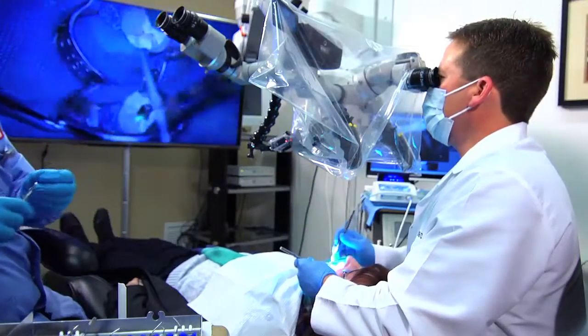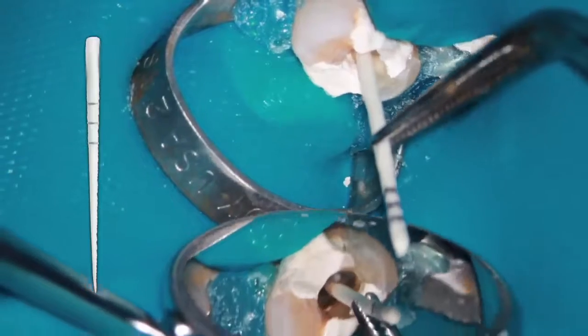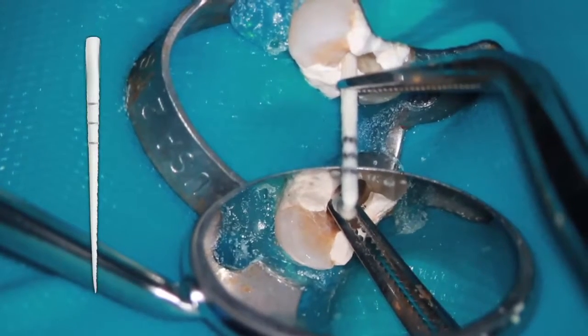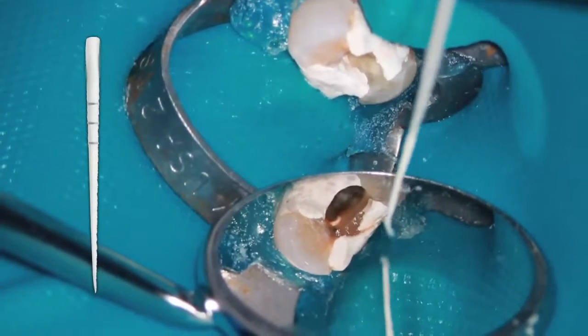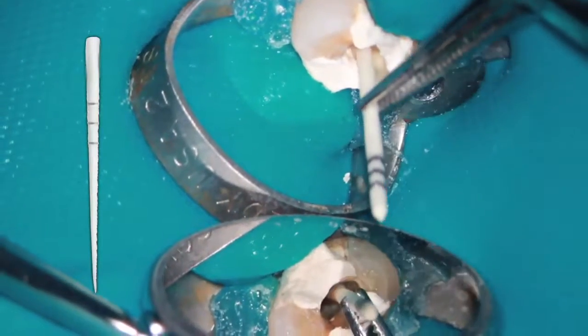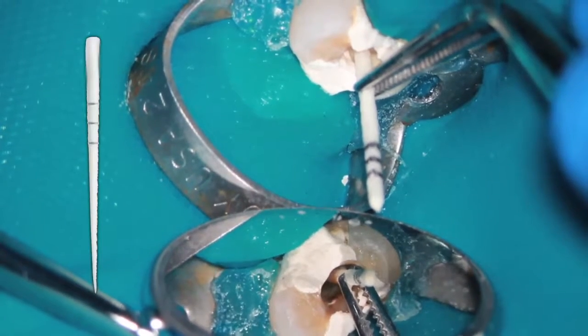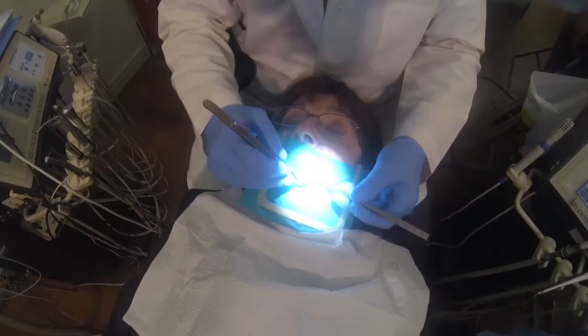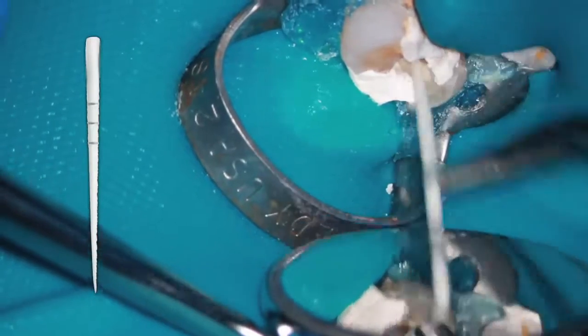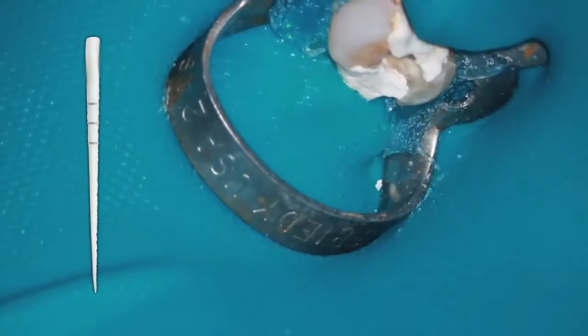Take a second paper point, also set for our working length. Here, very gently, place it in on the buccal aspect of the same preparation, right to there. Hold it, and come out and tap. And as you can see, less bending occurring. Another one from the lingual aspect. And here we're down the lingual wall to working length. And just a little bit on its tip. This paper point is set for 1/2 millimeter longer than my working length, so all I'm going to do is very gently slide it down that 3D anatomy and come up short of that. She's right there. She's good.